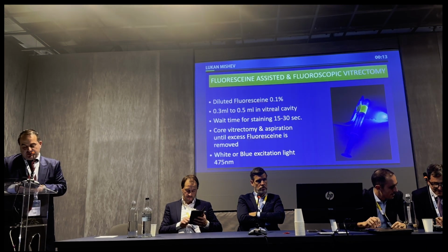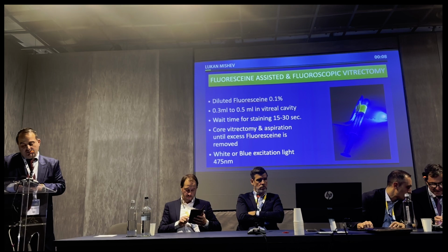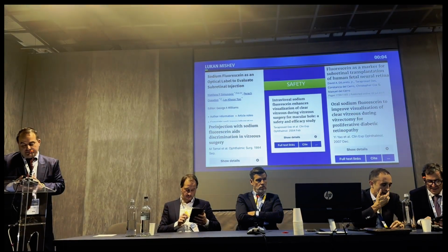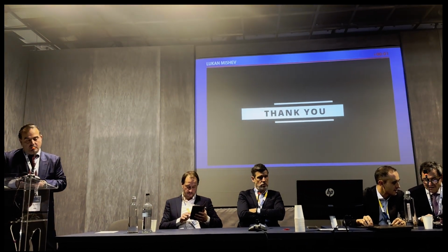This is the recipe which I'm using, with as low a concentration and as low a quantity as possible, and the safety is proven, as it is being used as a marker for subretinal implants, so it's completely safe.